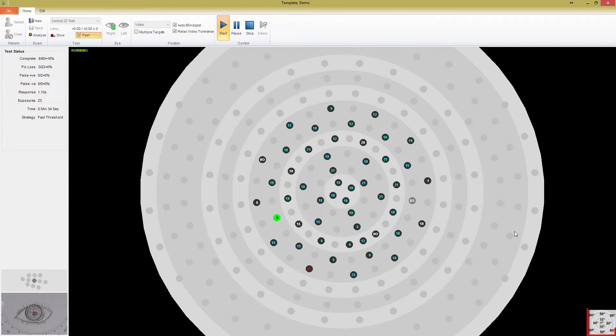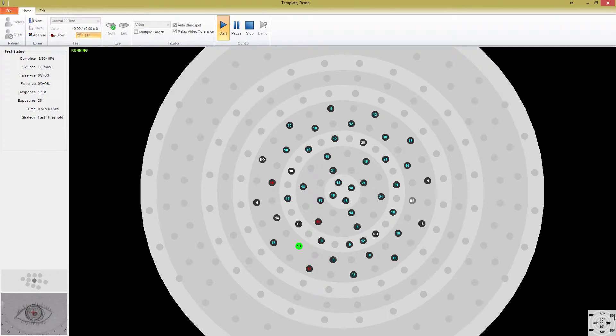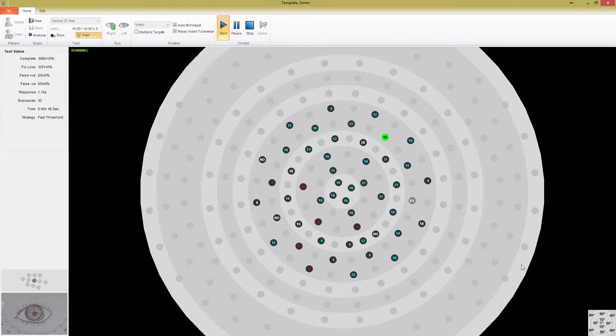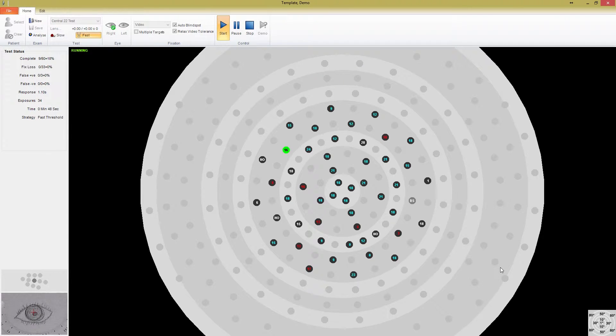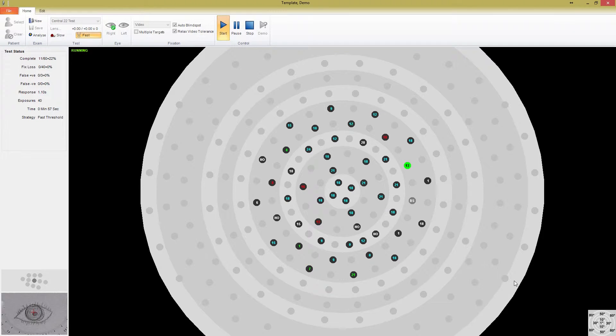If you glance at the bottom left corner, you can see a simplified representation of what these rings are. An important point to be aware of is that the 60, 70, and 80 degree rings are in reference to an eccentric fixation point, which requires the patient to shift their fixation either to the left or the right. When asking a patient to change fixation, you may want them to slightly tilt their head in the direction of the fixation target, as well as shifting their gaze.